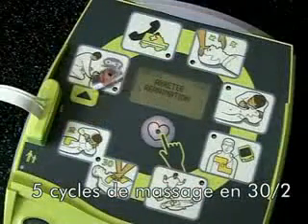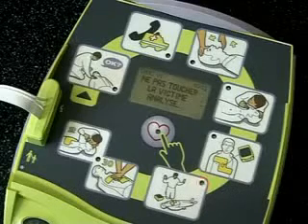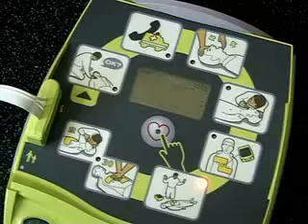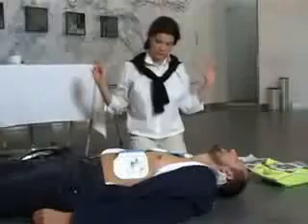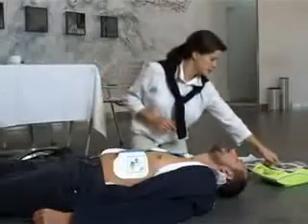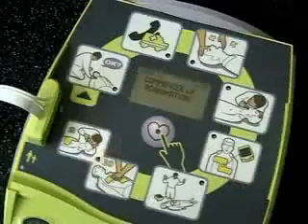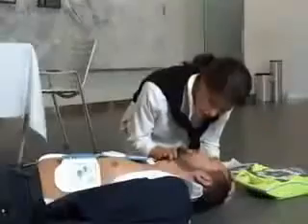Arrêtez la réanimation. Ne pas toucher la victime. Analyse en cours. Ne pas toucher la victime. Appuyez sur le bouton de choc clignotant. Choc délivré. Commencez la réanimation.